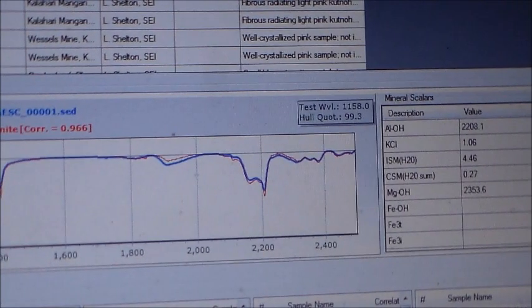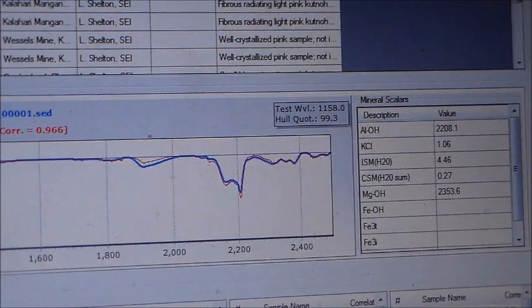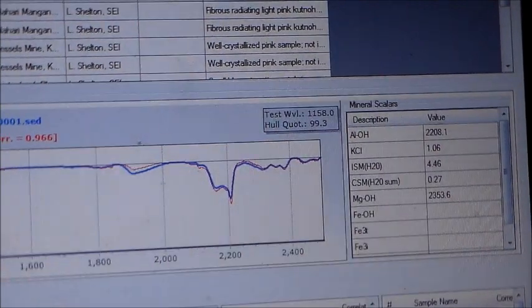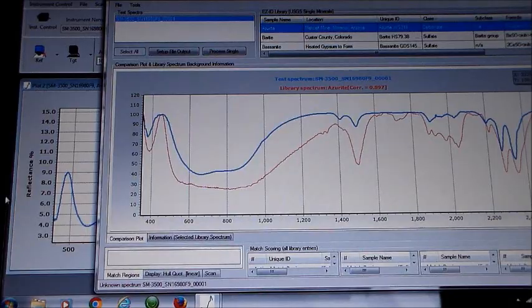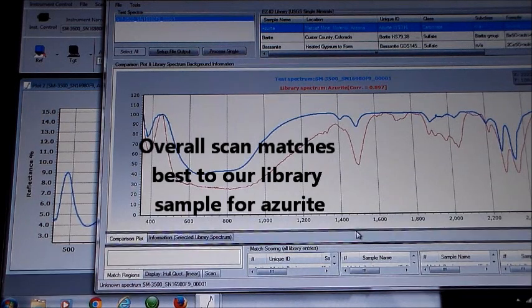To provide additional understanding of your samples, EasyID has added scalars. Scalars can enhance the geologist's understanding of crystallinity changes, alteration pattern shifts, and geochemical conditions at formation. In this example, we will use the USGS single mineral library to scan a blue feature in a sample using the mini-probe.